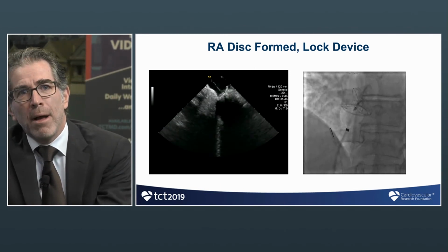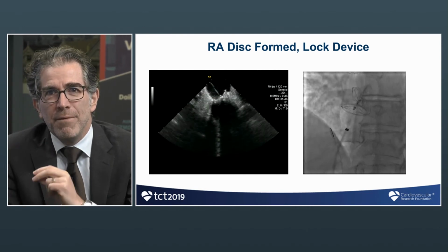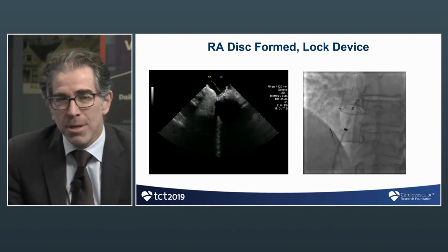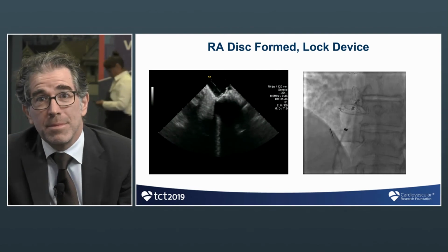Something I did not mention is I tend to save the ICE video as I'm deploying the right disc, to make sure that you capture the septum secundum. Good. It's more important than cine. Right. So a couple of other key elements. You have that Pac-Man appearance. You can see that your right atrial disc is up to the top of the secundum. The LAO projection. Yep. In this projection, and also on your ICE image, beautifully encapsulated.